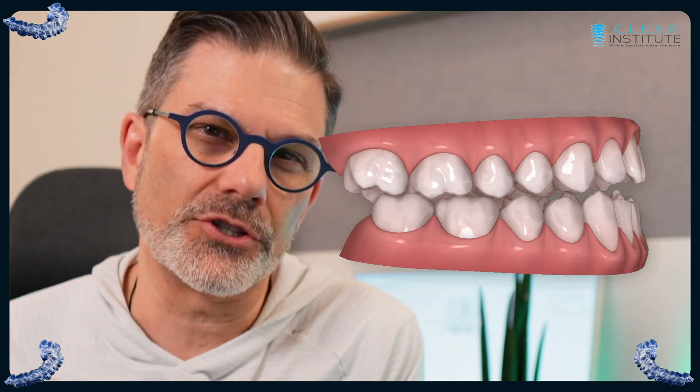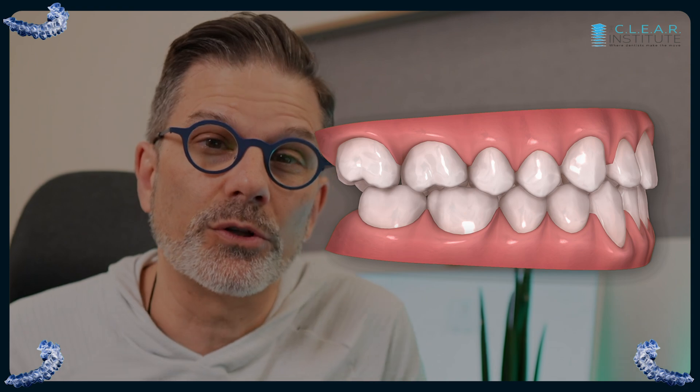Have you seen this in your ClinCheck? The teeth move, spaces are created between the teeth, nothing touches anymore, and suddenly — bam — a big jump, and everything's in occlusion. There's a lot of confusion about this, and I receive a lot of questions when I lecture live or from our online courses about this situation. So let's take a look at what it is exactly, why you see it, and sometimes why you don't. In this video, let's be clear about the bite jump.